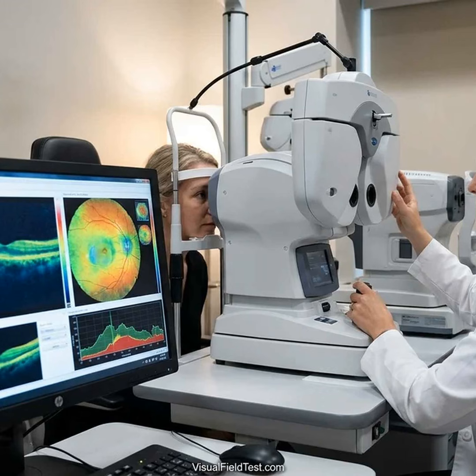Software segmentation errors. OCT relies on software to draw lines around each retinal layer. If the algorithm gets confused, it might misdraw the RNFL boundaries. This happens often in eyes with unusual anatomy. For example, high myopia, extreme nearsightedness, or tilted optic discs can throw off segmentation. In a recent study, about 52% of highly myopic eyes had apparent OCT artifacts, and software often misplaced the RNFL edges. This means an eye that truly has a healthy thickness can be mislabeled as thin. Therefore, in very myopic patients, doctors inspect every OCT layer on screen.